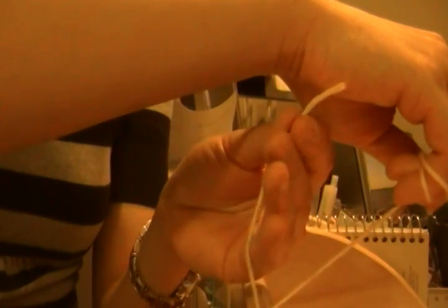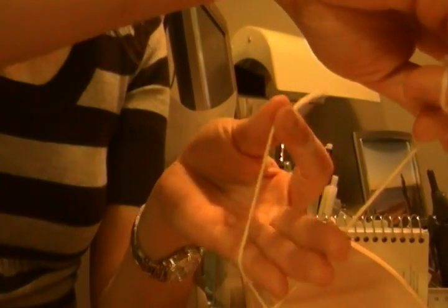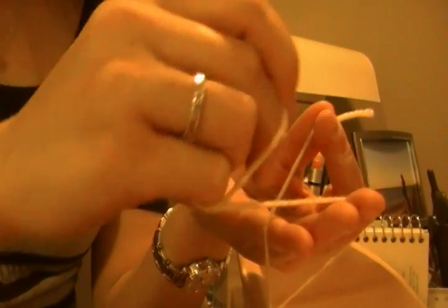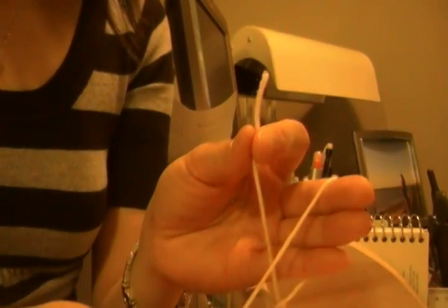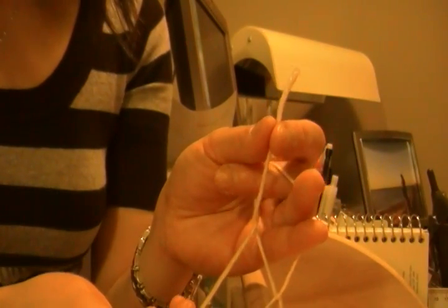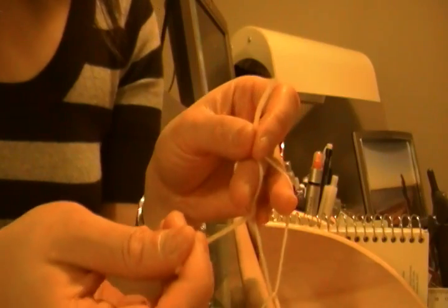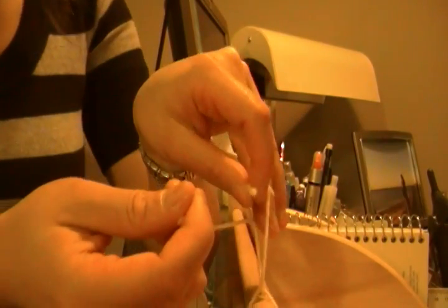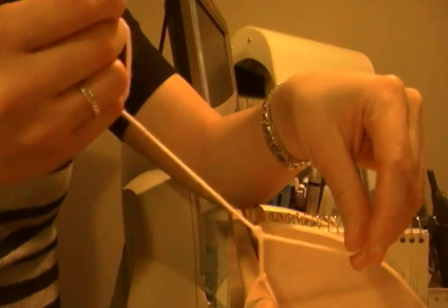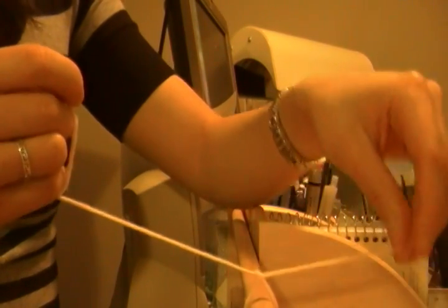Then I simply tie. I'll end up in this orientation here, where I'm holding it like this. Then with my index finger and my thumb this time, I'm looping the right-sided suture around like that, using my middle finger to loop underneath and then around, just like before.